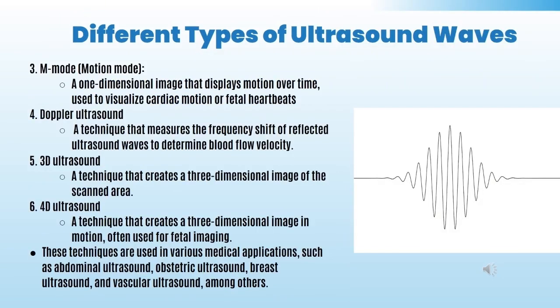We also use M mode. Motion mode is what M mode stands for. It's a one-dimensional image that displays motion over time, used to visualize cardiac motion or fetal heartbeats. As an echo tech myself, I'm very familiar with M mode.